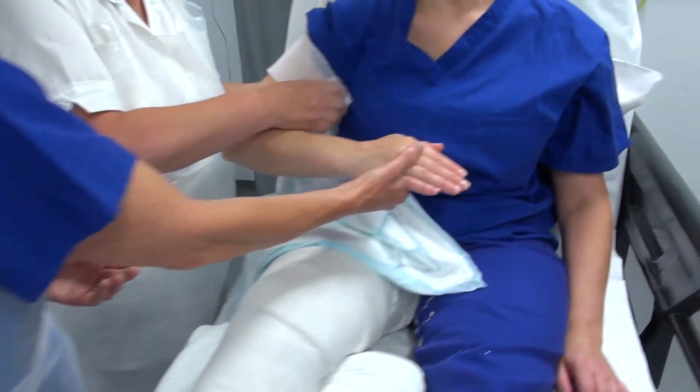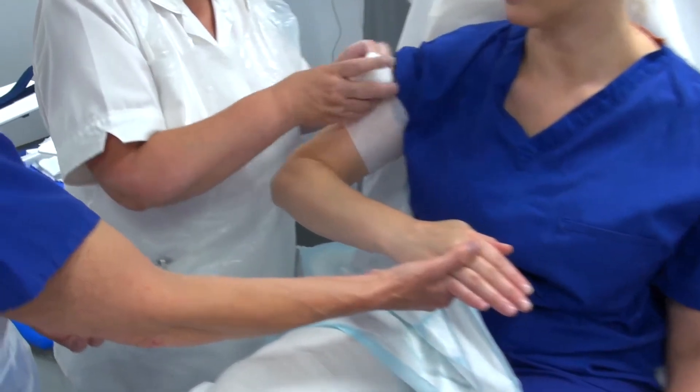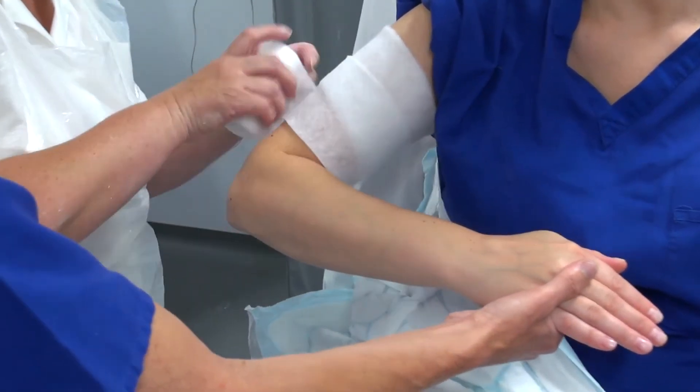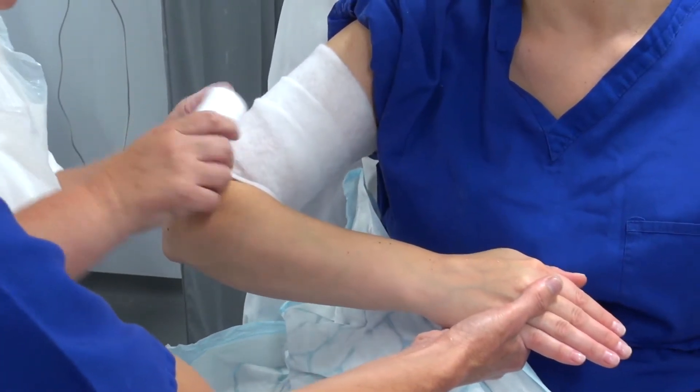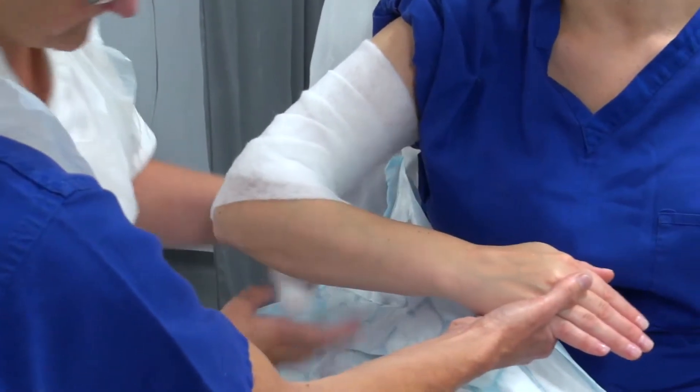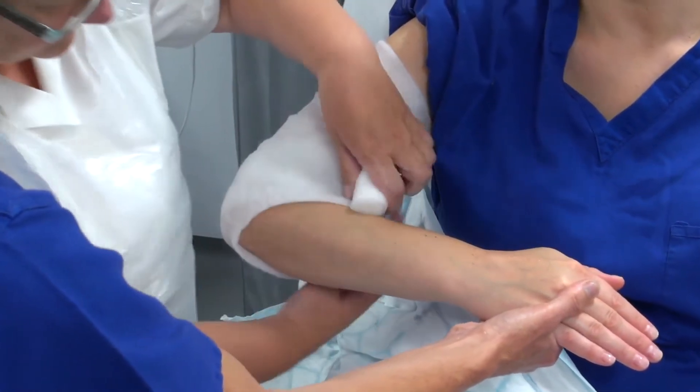First of all we're going to apply some padding, again just above mid humerus, because we need to allow for a turn back. We're going to work around the elbow and then down just below the mid radius, so again she'll have a turn back at the bottom.